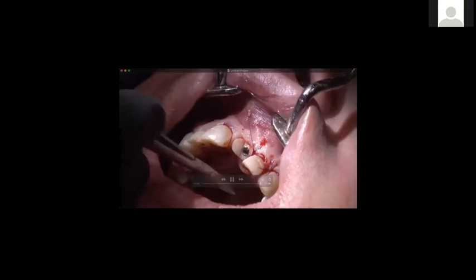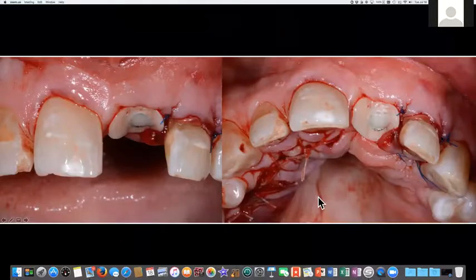So let me now go back, if I can, to that presentation. And all right, so now this is the situation. This is where our graft came from. It was quite a large graft, going all the way from the mesial of this premolar, distal of the canine, all the way to number 9. Custom tissue former. We're still on the video there. You need to minimize that. Oh, it switched again. Okay, hold on one second. Okay, now. There you go.